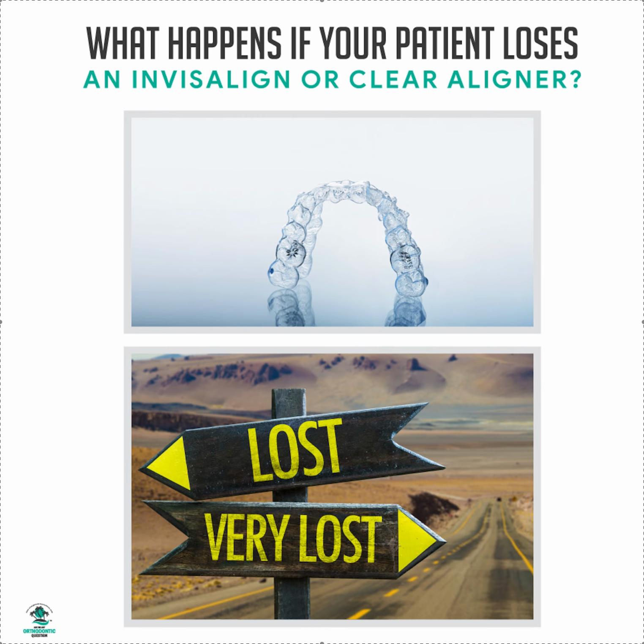It's really nice if you provide them a box to put them in because you don't want to put them back in the bags. They get nasty. They need to bring that entire box to the appointment. And there are plenty of orthodontists that make cool custom boxes. If you go into my YouTube channel, it might be under take home or tracking. But take a look, I have this little demo box. I'm not that crafty, but if someone in your office is crafty on Cricut, they can make it look cuter. I spent like $6 on mine. It was worth it. But in any case, patients need to save all their old aligners.